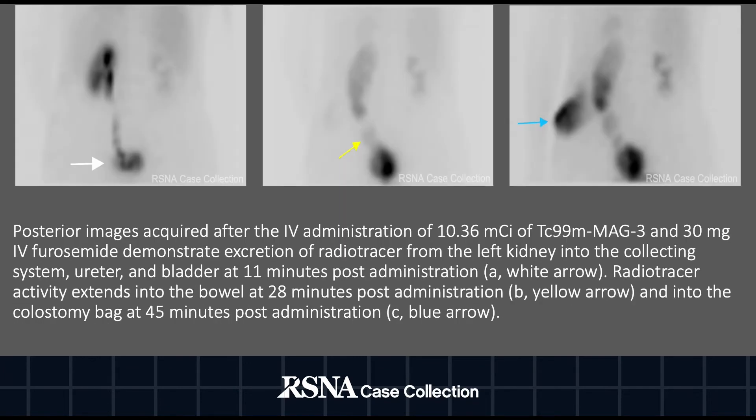Here are a few static images from that dynamic scan. On the image to the left there is excretion of radiotracer from the left kidney into the collecting system, ureter and bladder at 11 minutes post-administration as demonstrated by the white arrow. In the middle image radiotracer activity extends into the bowel at 28 minutes post-administration as demonstrated by the yellow arrow, and up into the colostomy bag at 45 minutes post-administration as demonstrated by the blue arrow on the right image.